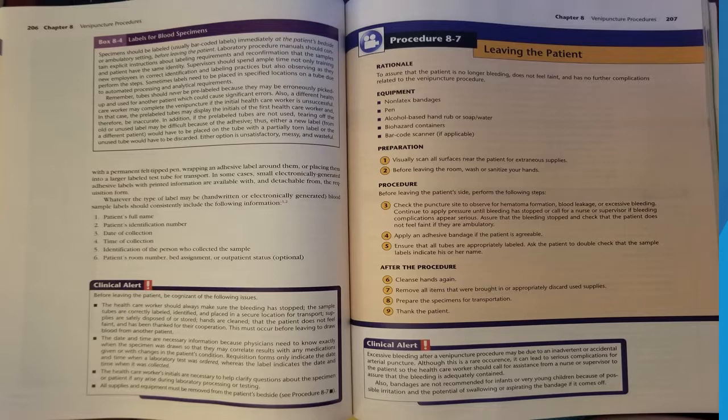Clinical alert. Before leaving the patient, be cognizant of the following issues. The healthcare worker should always make sure the bleeding has stopped, the sample tubes are correctly labeled, identified, and placed in a secure location for transport, supplies are safely disposed of or stored, hands are clean, the patient does not feel faint, and has been thanked for their cooperation. This must occur before leaving to draw blood from another patient.